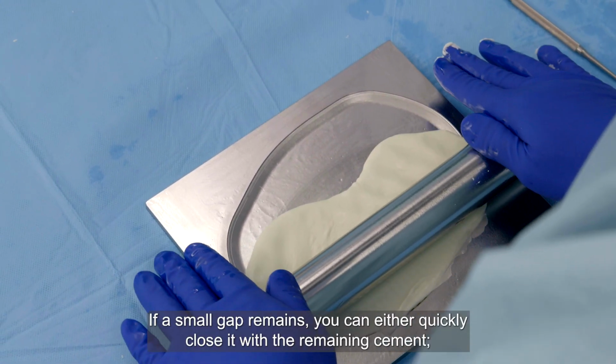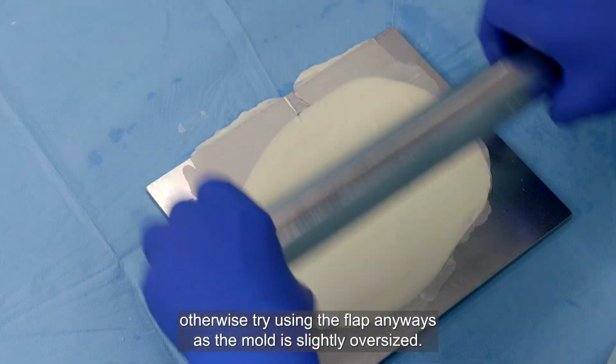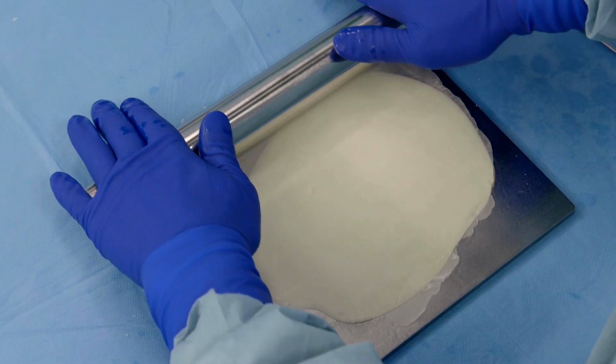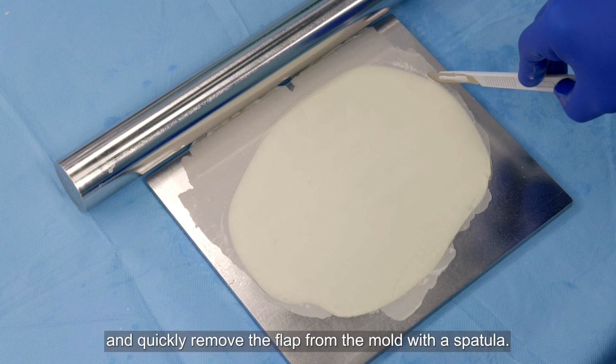If a small gap remains, you can either quickly close it with the remaining cement, otherwise try using the flap anyways as the mold is slightly oversized. Remove the excess cement with a scalpel and quickly remove the flap from the mold with a spatula.